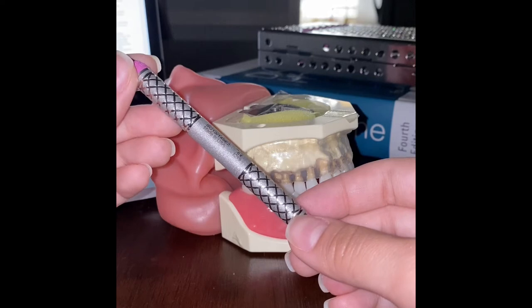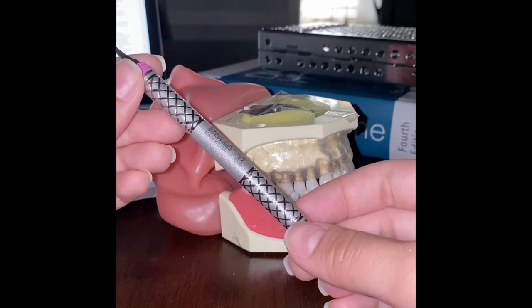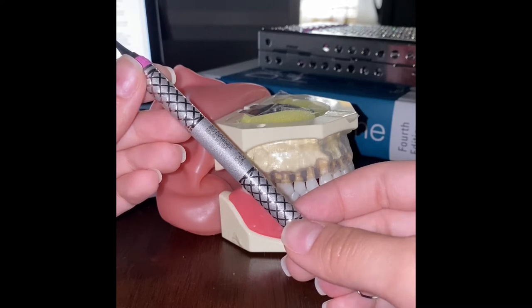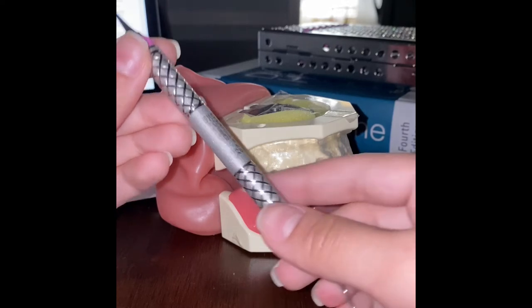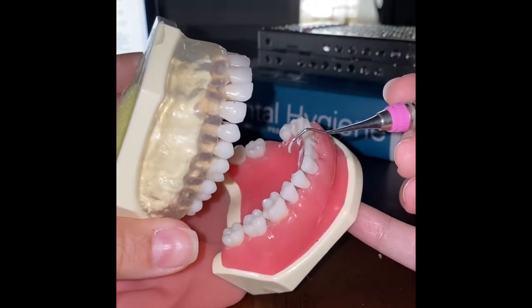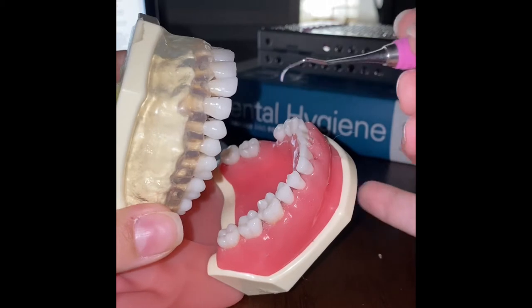The indications for the 1314 are that it can be used on both posterior and anterior teeth. For anterior toward surfaces, we start at the midline of the tooth and instrument toward until fully interproximal. For anterior away surfaces, we start at the midline of the tooth and instrument away until fully interproximal.